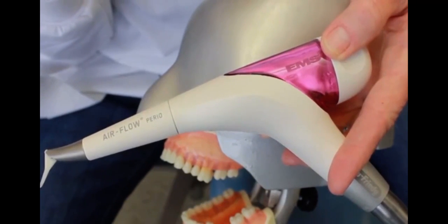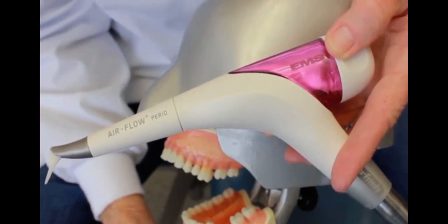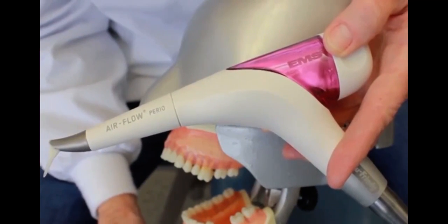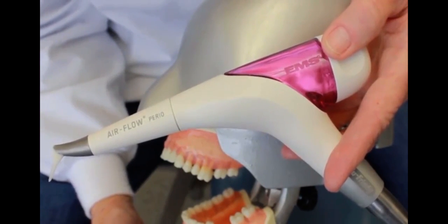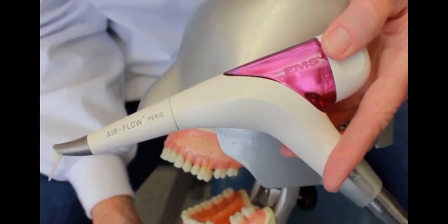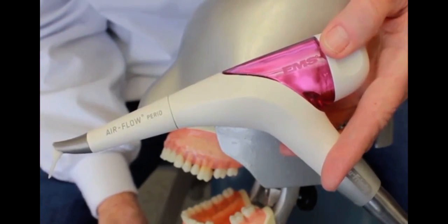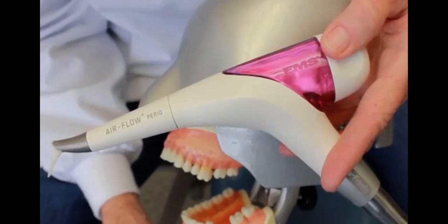It's pretty simple and pretty fast. The idea behind this new technology is to air polish before you do any of your debridement. Air polishing will remove the biofilm, but it certainly will not remove calculus. So in order to speed your treatment along, this helps remove the biofilm and then you just need to go in and selectively remove calculus deposits.